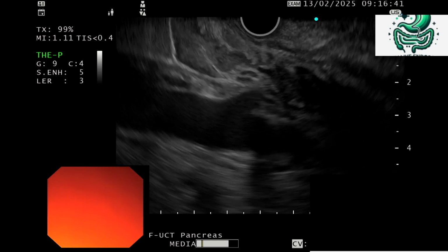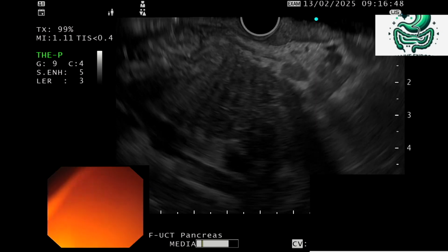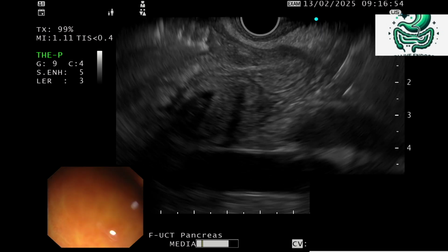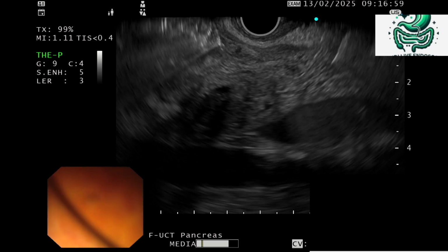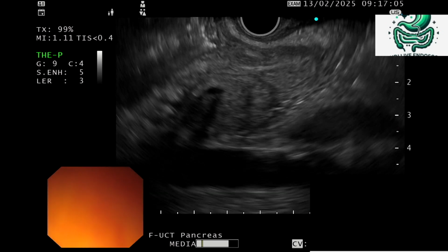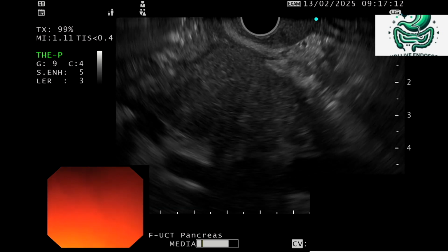There is not much data on elastography, but we always look at the imaging, whether there is a reduction in the sausage-shaped pancreas. We also remove the CBD stent and see whether there is a resolution of the stricture. These are the things, but for follow-up elastography, I don't think there is much data to compare before and after and plan the treatment, because this is more of an edematous pancreas.